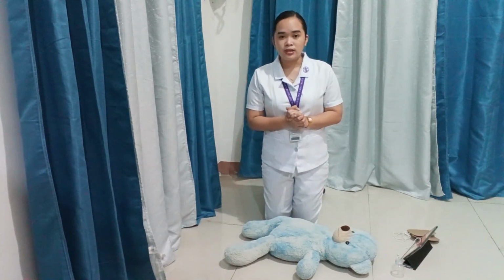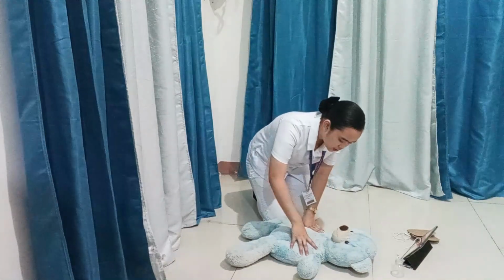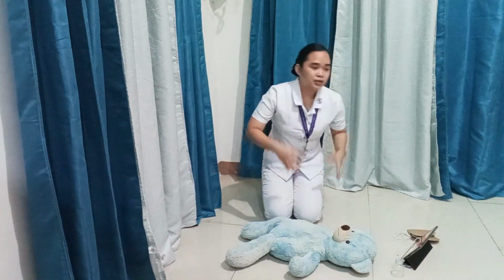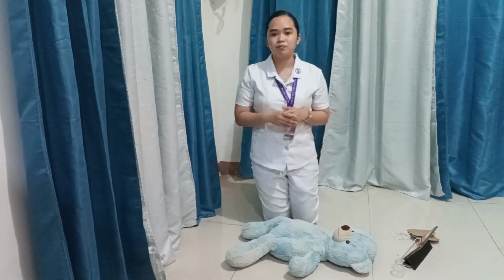So first procedure is that we will be shouting for help. Sir, sir, are you okay? Sir, sir, are you okay? The patient is unresponsive. Somebody help me, please.